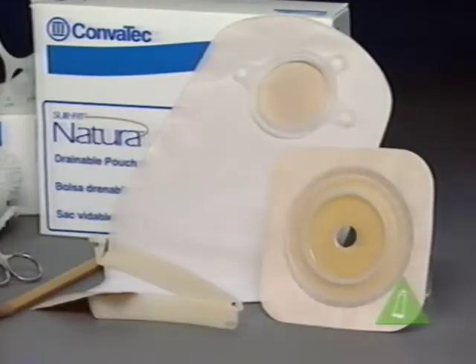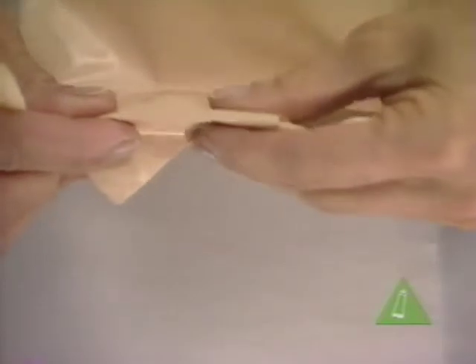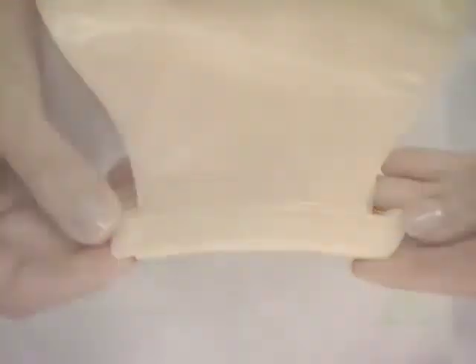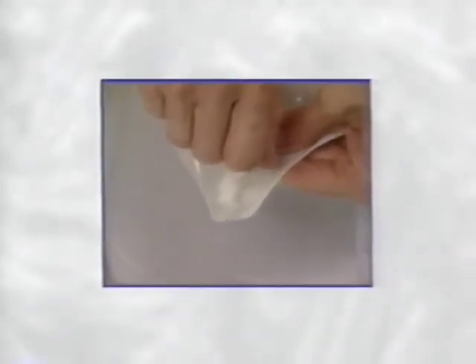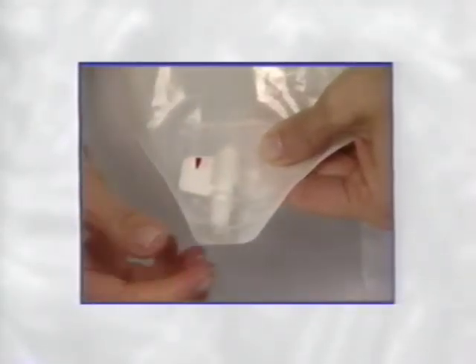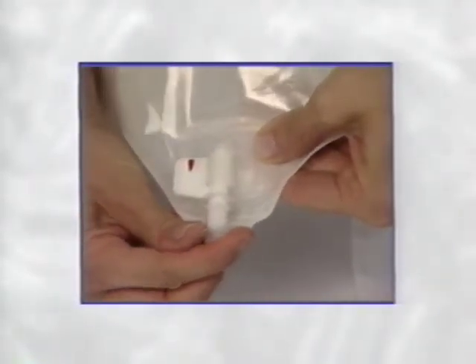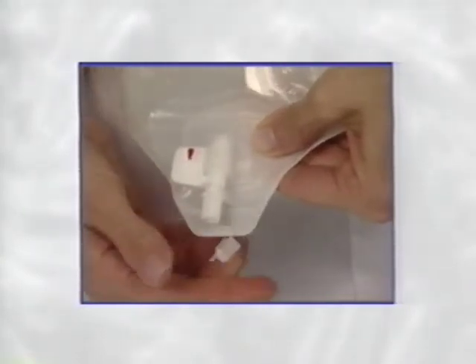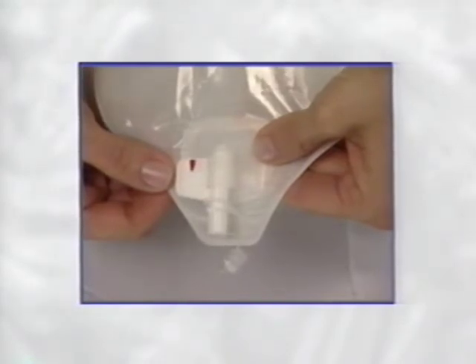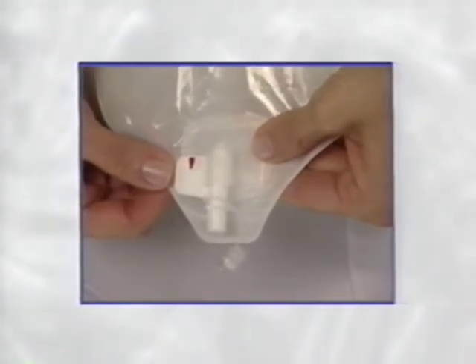If you're using a drainable pouch, apply the tail closure. Simply fold the end of the pouch over once, slide the tail closure over the fold, and snap it closed. SureFit urostomy pouches feature the AccuSeal tap, which securely closes the pouch while you are wearing it and allows easy draining. Simply twist the swivel valve so that the red dot faces away from your body. This indicates the tap is open, as you see here. The tap can also be attached to a nighttime drainage system if you wish.